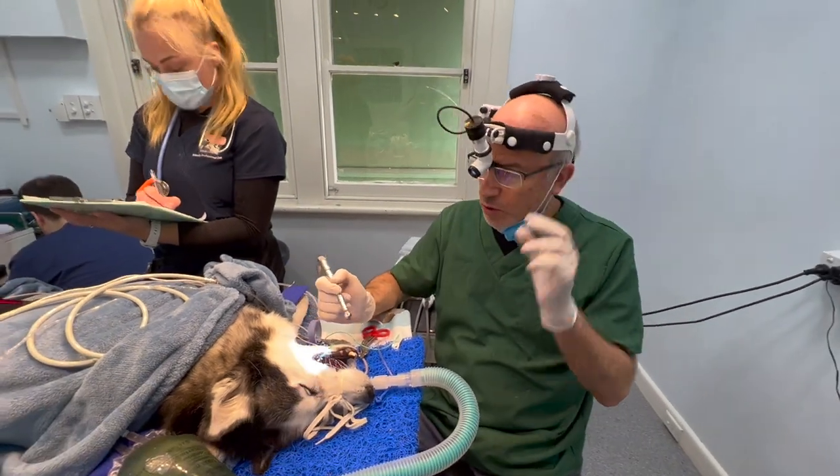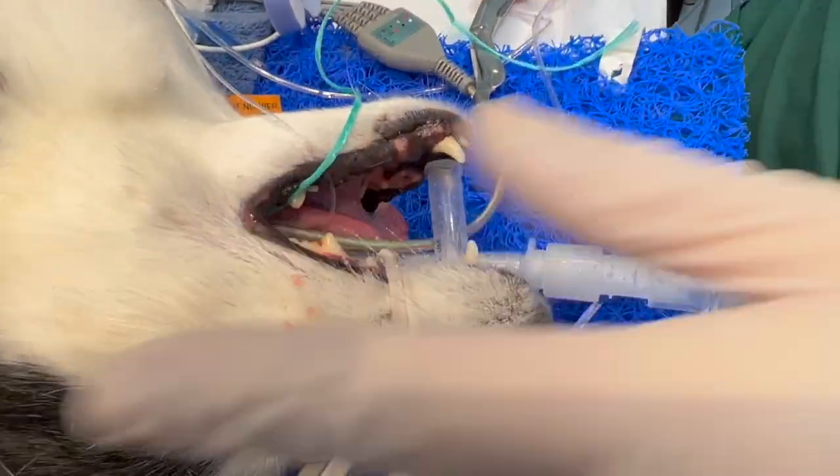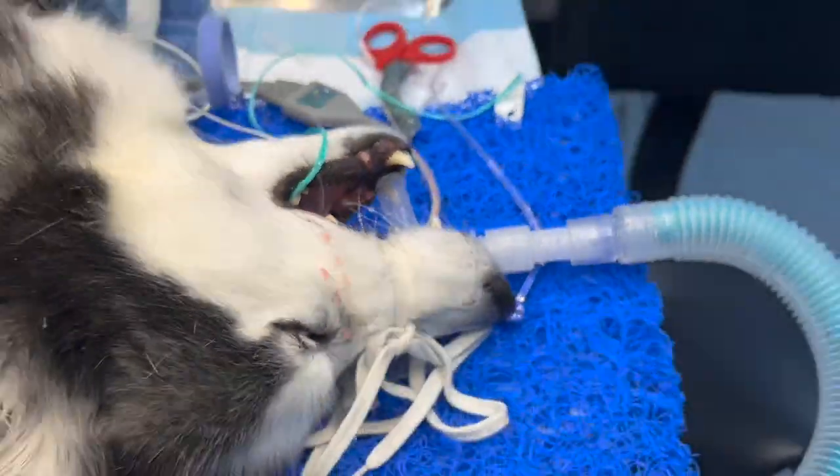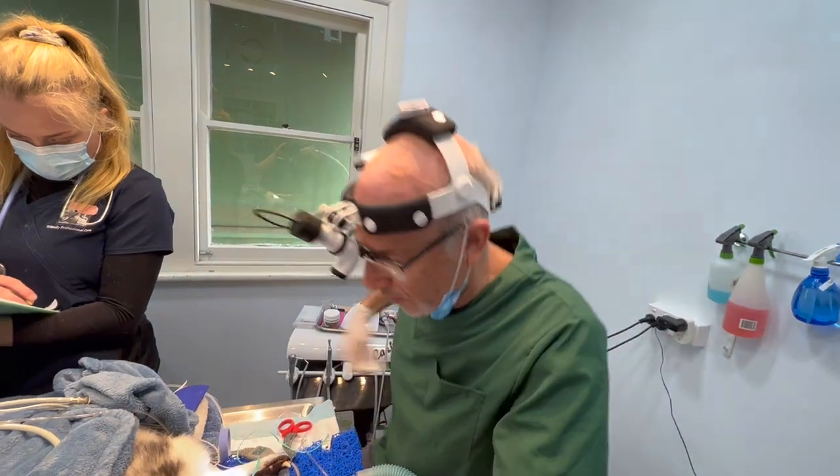I'm taking a molar tooth, which is a massive tooth — you can actually see the tooth. I'll swab and you can show. This tooth has got three big roots.